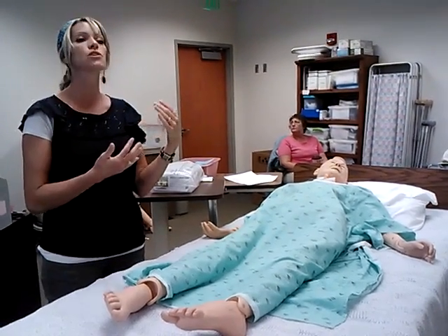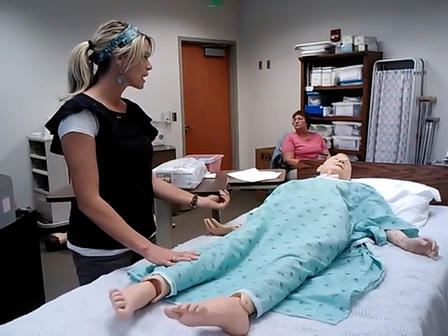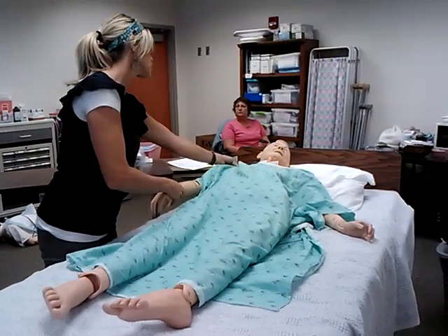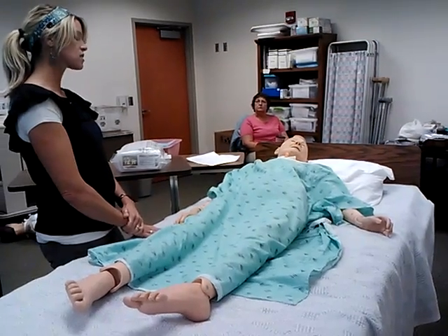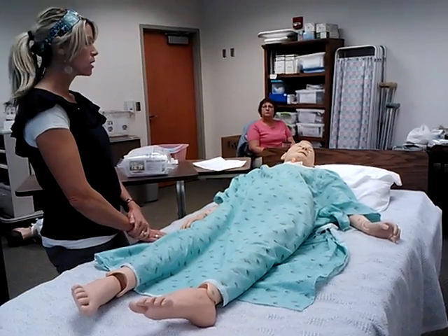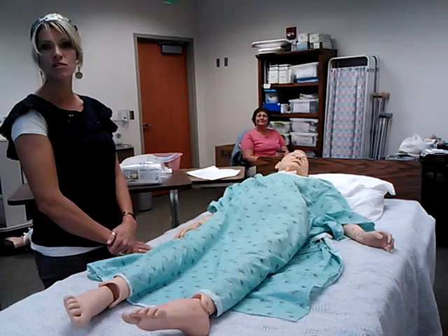And then you're going to, like I said, wash your hands. You're going to identify the patient, and you're going to have him tell you his name. Hi, Mr. Jones, how are you today? I'm your nurse, Jennifer. And we're going to put a catheter in because you're having difficulty urinating. So what's your birthday? So he'll tell you his birthday. He'll tell you he doesn't want a catheter. And you'll tell him that the doctor's ordered it.